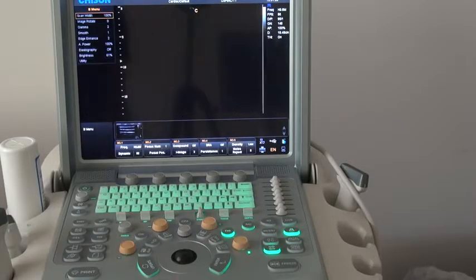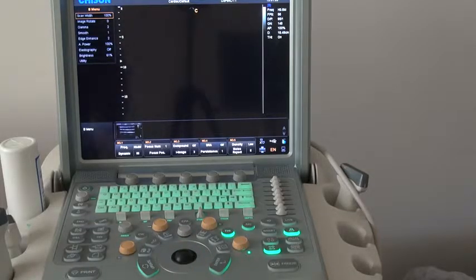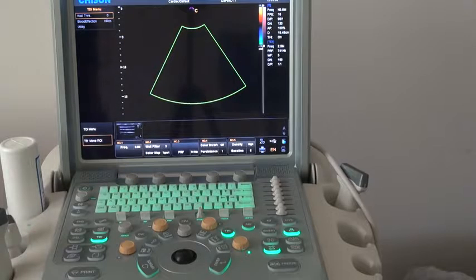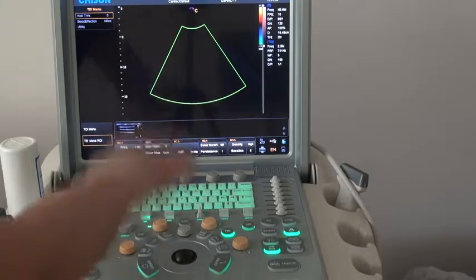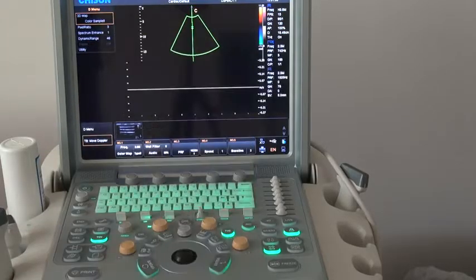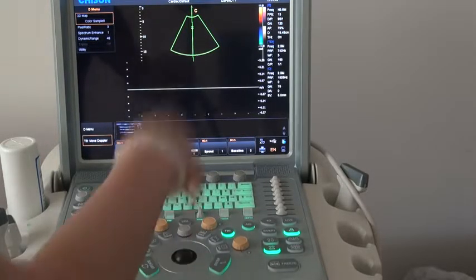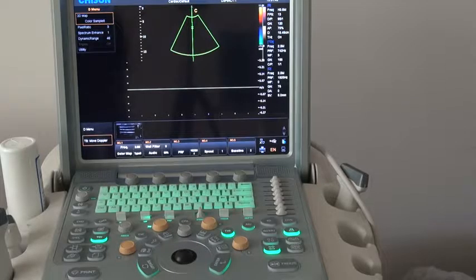After that, go back to B mode. If you want to enter TDI mode — Tissue Doppler Imaging — press the TDI key to go into TDI color mode. After that, press the PW key to go into TDI PW mode. Press the update key to get the TDI PW spectrum.